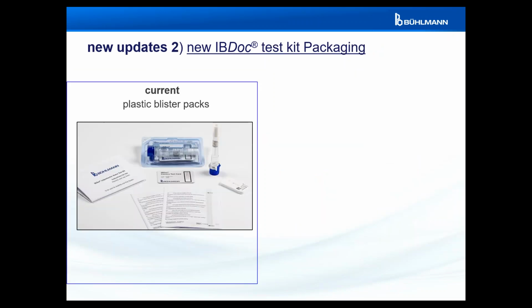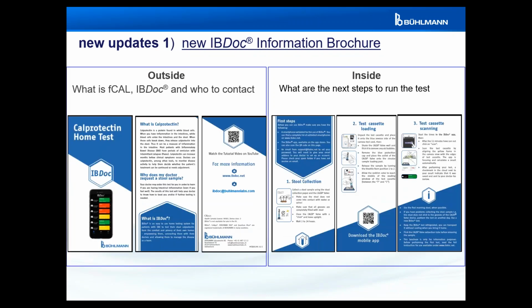Colin, can I just make a comment there? Yeah, definitely. Just because we're on the phone anyway. One of the things I would really suggest, under the stool collection portion on the inside of this new brochure, where it says wait 2 to 24 hours, can we bold that and make it very, very visible? Because it's not visible and people miss it. Yep. And you definitely mentioned that in your... I've mentioned it numerous times.